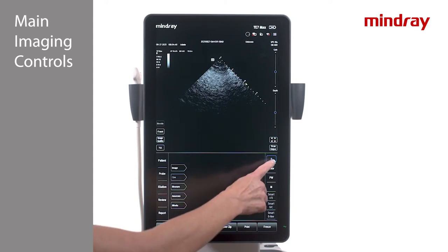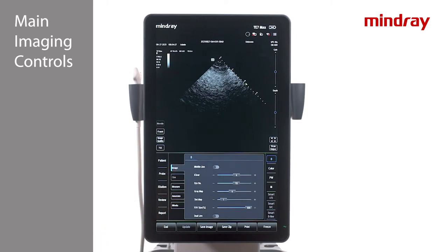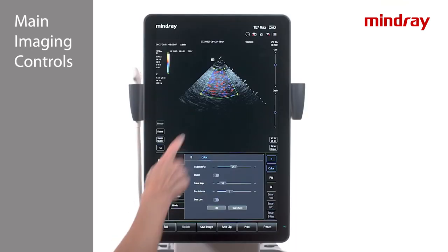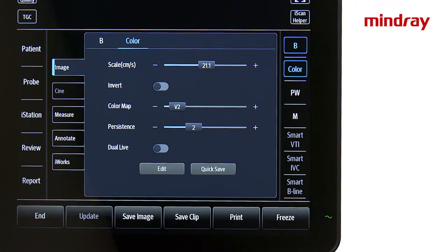Major modes are located on the lower right side of the screen. B mode is grayscale imaging mode. Pressing the Image tab, located in the lower middle section of the touch screen, will allow access to adjustment options for each mode. To turn on color, tap on the color key on the right side of the touch screen. Notice that the imaging parameters in the middle under the Image tab change to color.